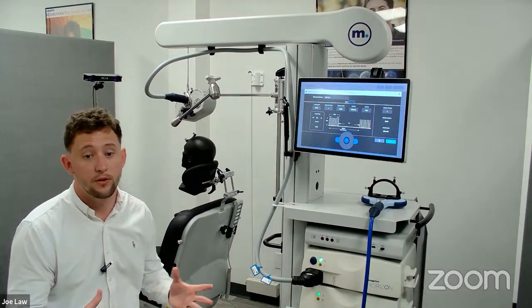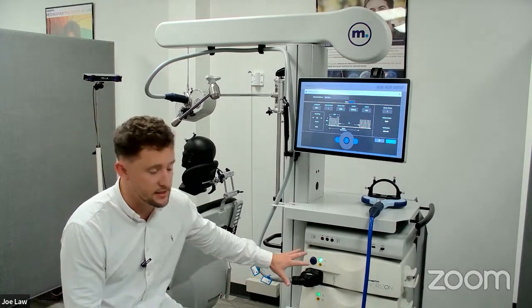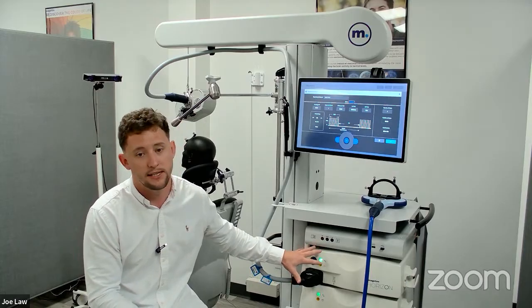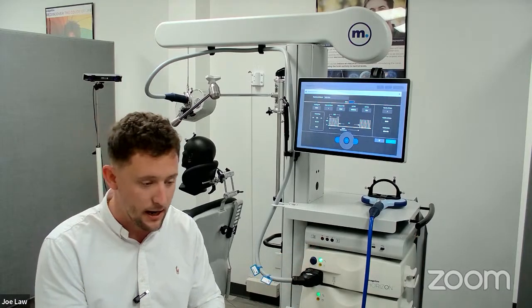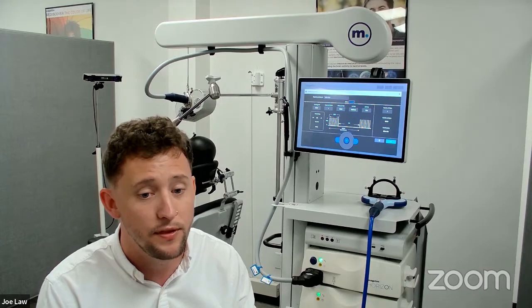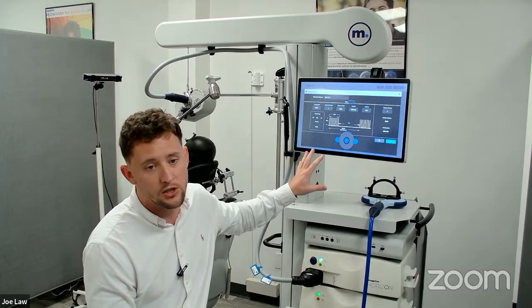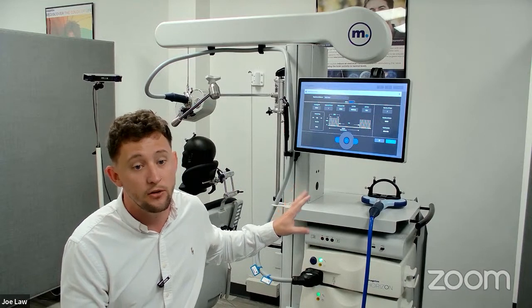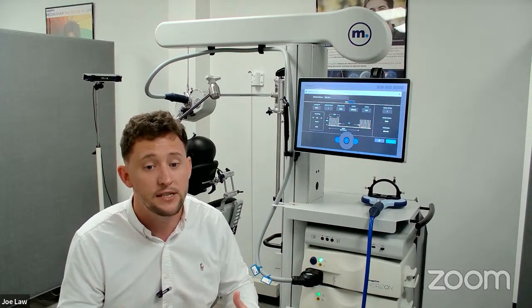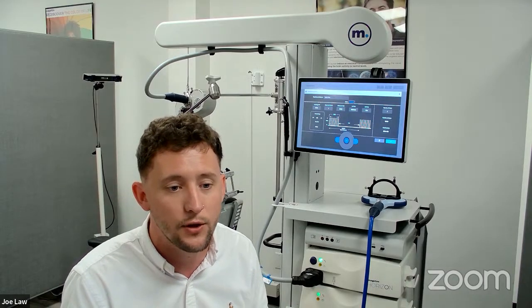So yeah, if that's what they're asking, output with regards to Tesla magnetic field output. The way our system works is there's an abundance of references within this system. So it looks at capacitance, voltage, current, all these kinds of measurements, and makes sure everything is still within tolerance. If anything steps out of tolerance, the system will display it to the user straight away. If it's something related to safety, the system is not going to allow you to continue, to make sure the system fails in a safe state. If it's something minor that the user can still continue working with, it'll allow you. It'll probably just warn you that maintenance is required, for example.